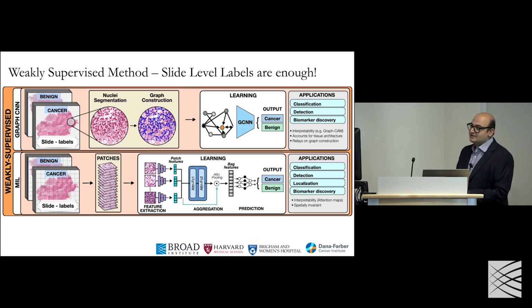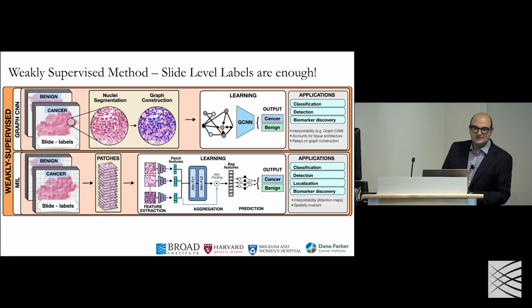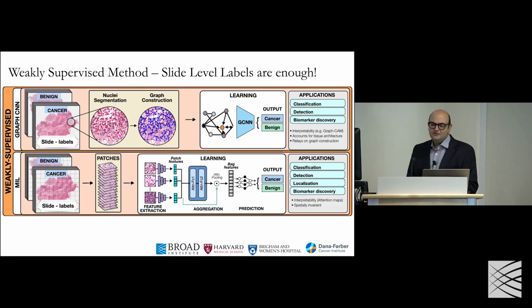And if you're using a max pooling based aggregation function, the assumption would be that even if one of those patches is positive, the entire slide would be considered to be positive. An issue with this approach is that this makes this setup inherently data inefficient, because the weights and biases of the model could be updated using a single 256 by 256 patch.